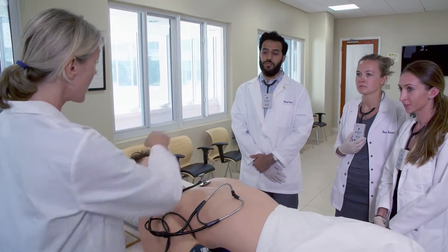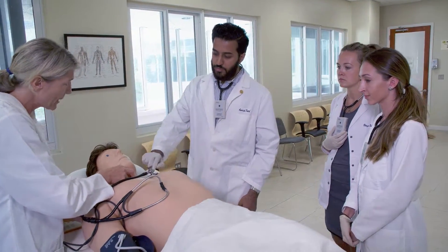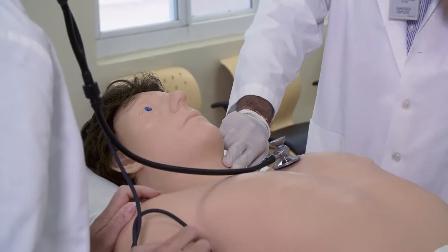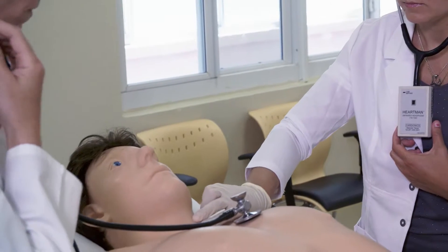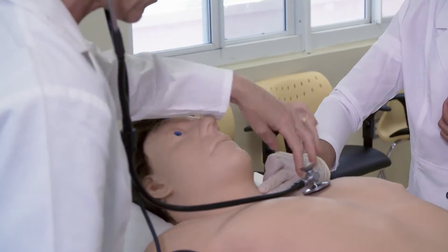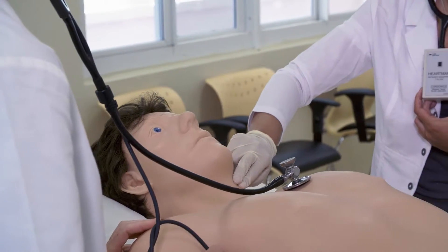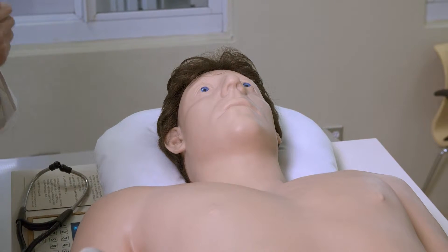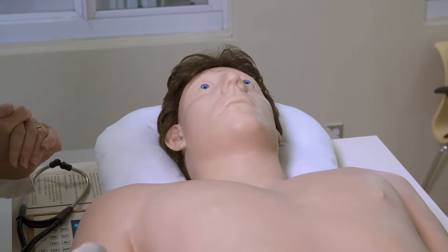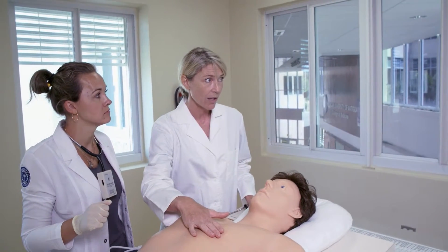Now let's think. Amish, would you like to come and palpate for the heart? How do you find the carotid? You feel the midline and then you take your fingers over to the first sulcus. And as he's breathing in — which part of the heart is the most mobile? Which is working the hardest? So that's the bit you're going to be able to feel. That is going to be where the left ventricle is working hardest.